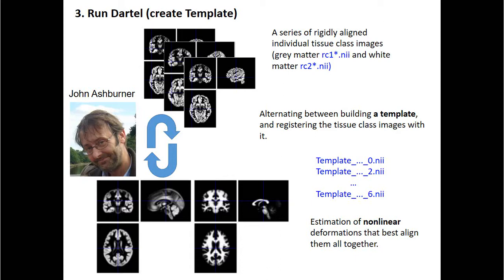The reference is not the template of one group. It is the common template of two groups. You have a group of Alzheimer, a group of healthy controls, and you collapse them and you create a common template. And then you incorporate covariates, age, gender, etc. So you fit them together so that the anatomy is precisely the same, but the deformations are different, obviously.